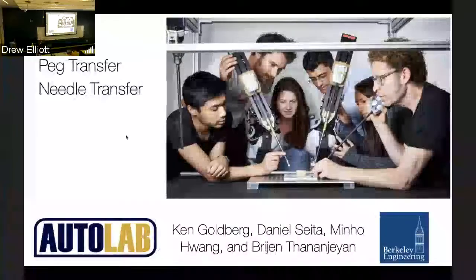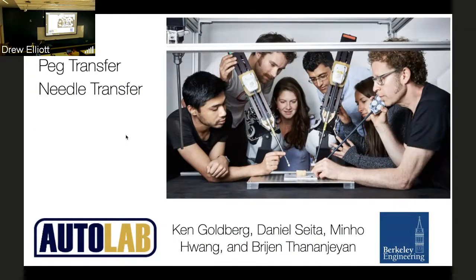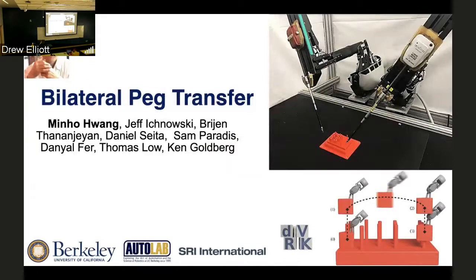What we're going to talk about in approximately 15, 16 minutes, we have some time for questions, is two new topics, which is peg transfer and needle transfer that we've been focusing on, and we have some new results over the past 6 months. So let's start with peg transfer. I believe everyone here is very familiar with this standard fundamentals of laparoscopic surgery task, which is using rigid objects, we call them blocks, moving them between different pegs.